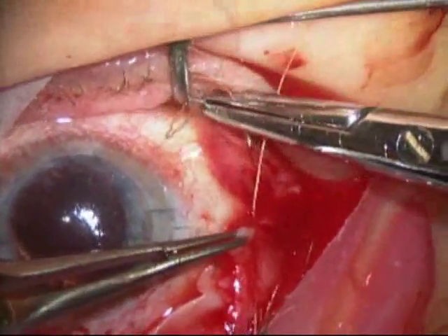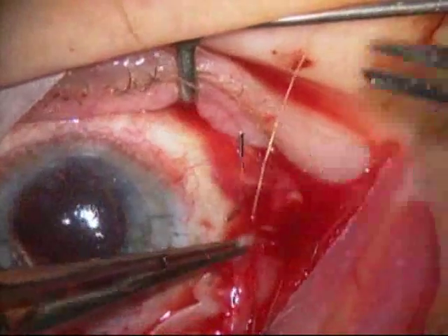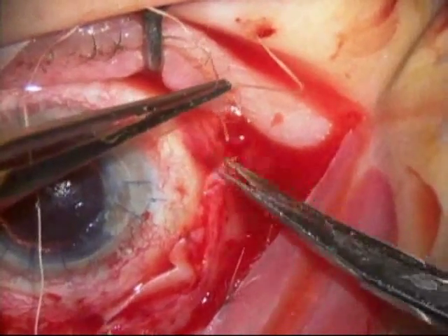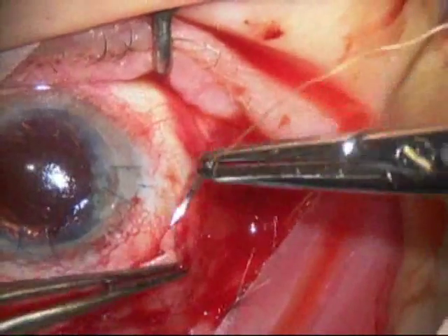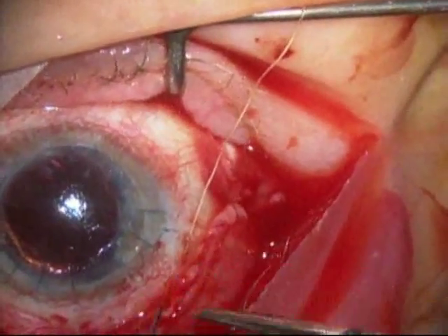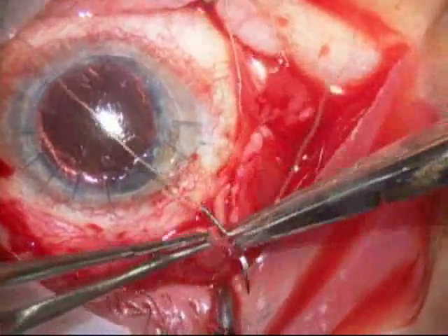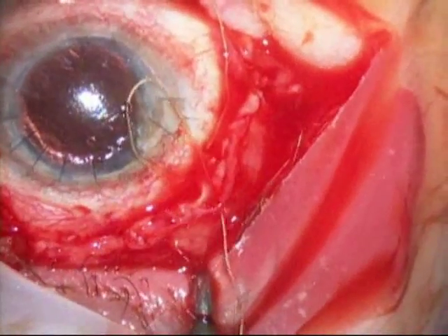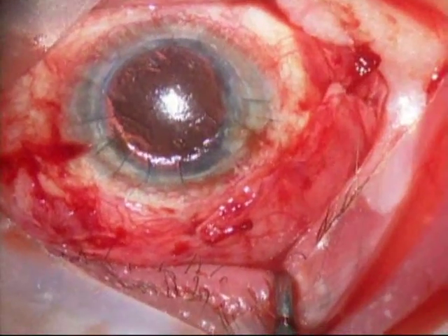I hope you found this video informational. Please feel free to look at other videos and informational pages at our website, which will be listed at the end of the video. This is Dr. Stephen Cohen, and again this is a video of an AMED valve placed on an eye that had previously had a scleral buckle for a retinal detachment repair.